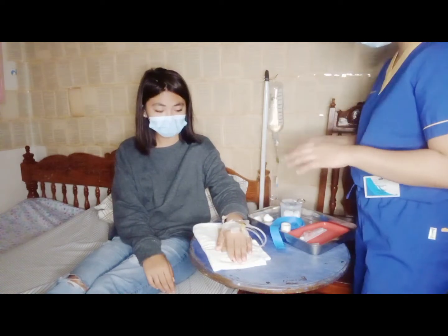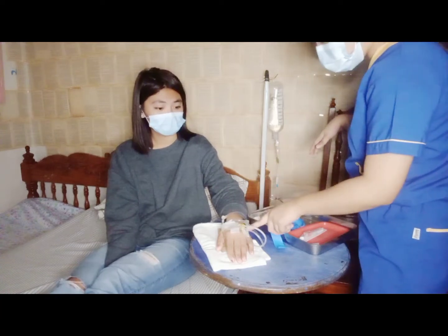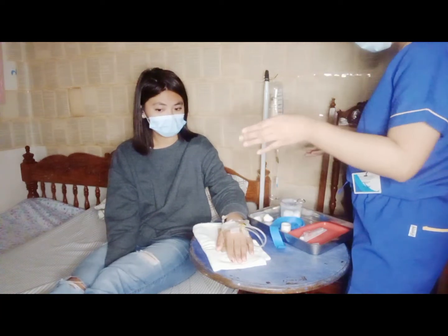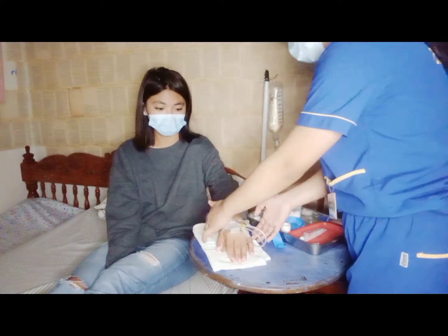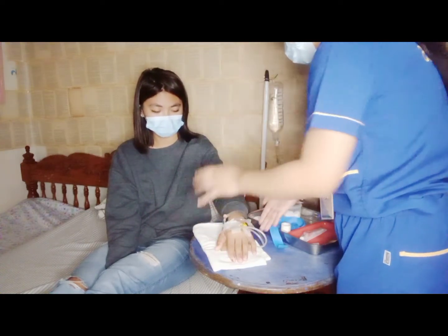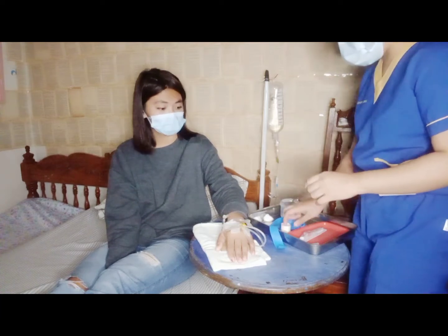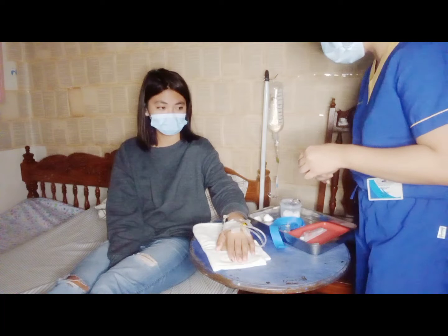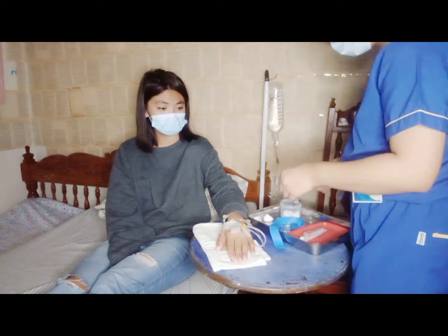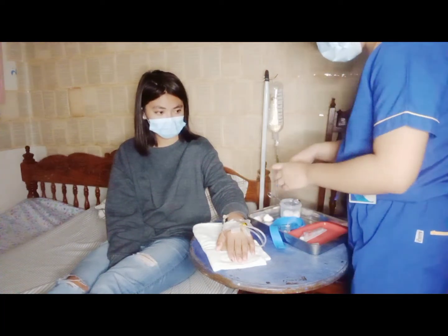Kung nakikita nyo po sa ibang mga patient, ma'am, na merong dugo dito sa part na ito, it's because igagalaw nila yung kanilang kamay. So, lalagyan kita ng ganito to safeguard the site and of course to prevent bleeding. So, pag igagalaw nyo yung kamay nyo, ma'am, dahan-dahan lang po para iwas yung sa paggalaw ng ating catheter. Okay ma'am?